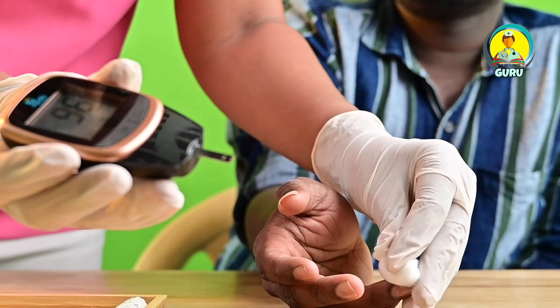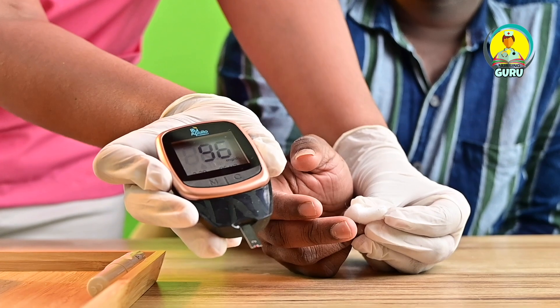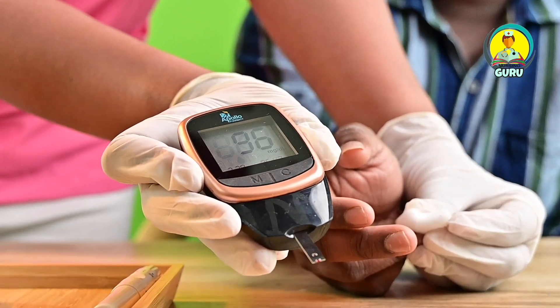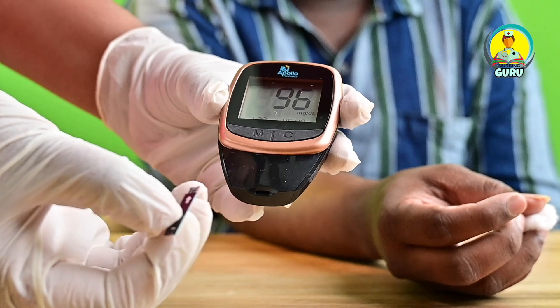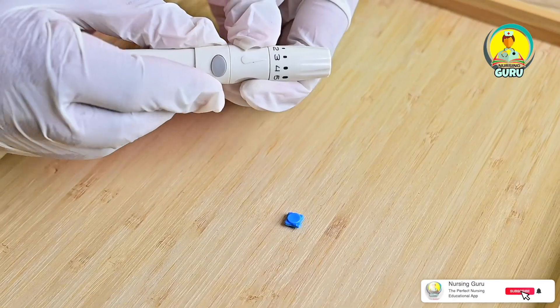Apply pressure to the puncture site using a dry cotton ball. Read the blood glucose result displayed on the monitor and inform the patient about the result. Then remove the strip and discard it in a container.